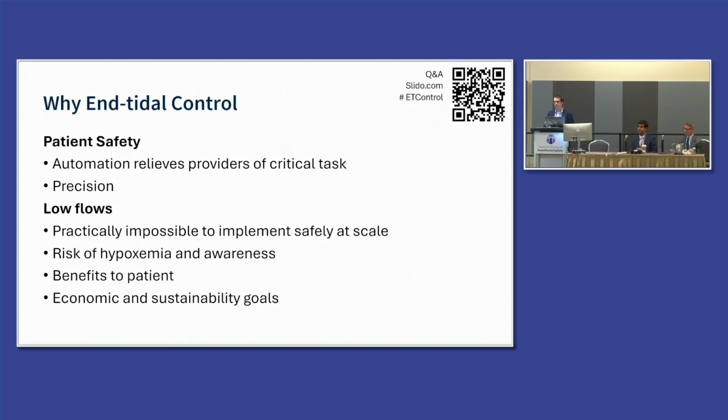I think if you went to your tertiary hospital and said, I want you all to use flows tomorrow at 0.5 liters per minute, I think you'd probably get a lot of hypoxemia and a lot of awareness happening if you didn't do any other training and any other study around it. And even if you managed to have an impact, that impact would fairly quickly drift off, and you'd have to be continuously re-educating, going around trying to get people to put their low flows on.